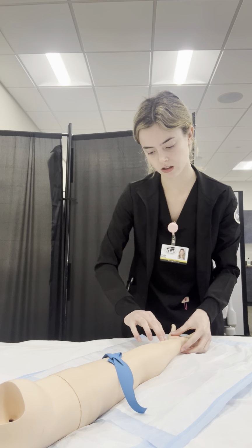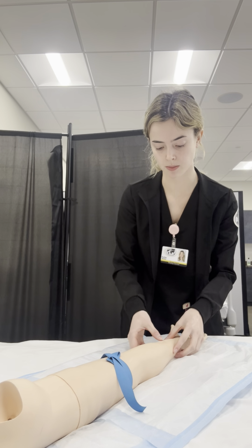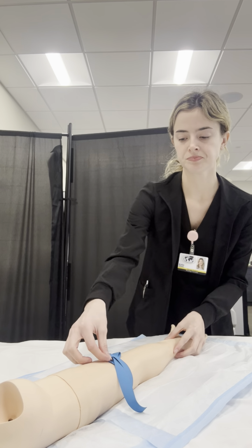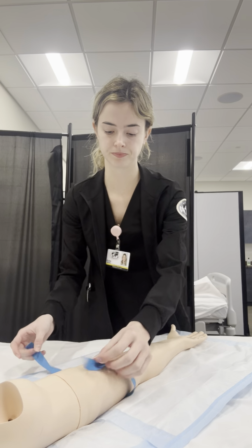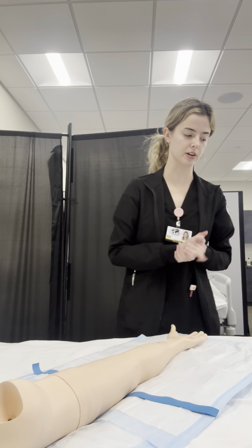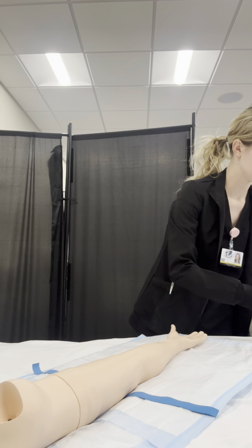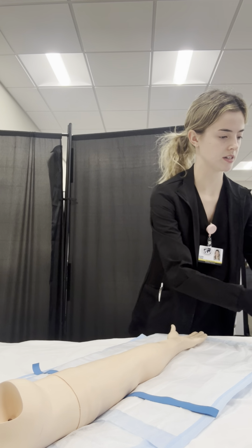Okay, so as I'm tapping this vein, it's bouncing back. It seems like an appropriate insertion site to use. So let's pop that tourniquet off. Leave it right here. I would instruct the patient just to relax, and I'm going to set up the rest of my supplies. So I'm laying out all my supplies.